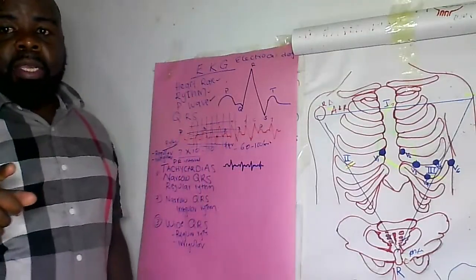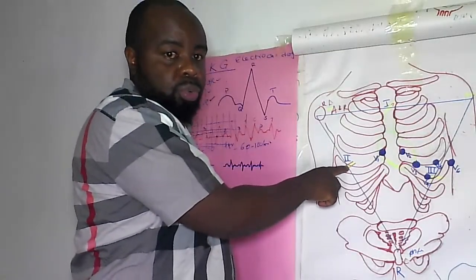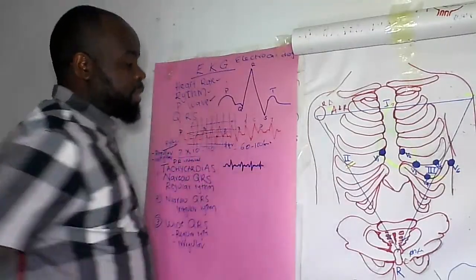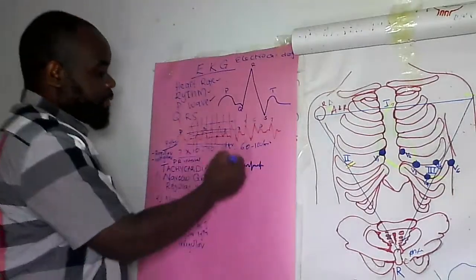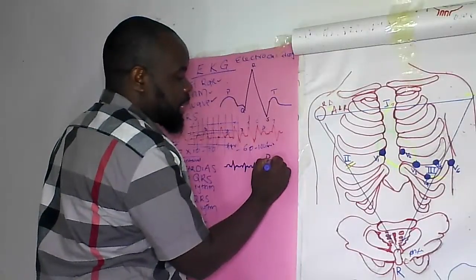Another thing is you check on lead 2. Check the P wave in lead 2. How is the P wave? In lead 2, you will see it is increased.